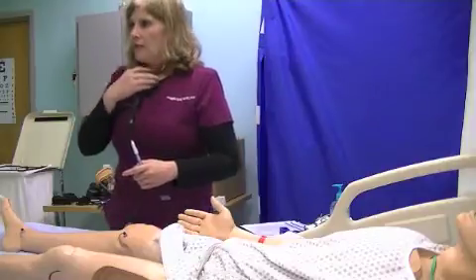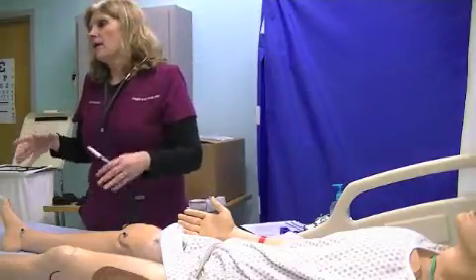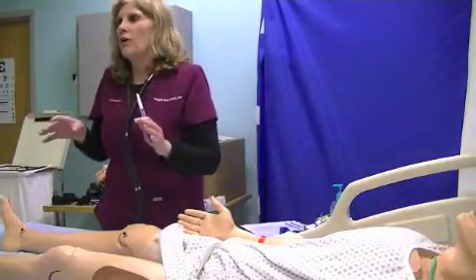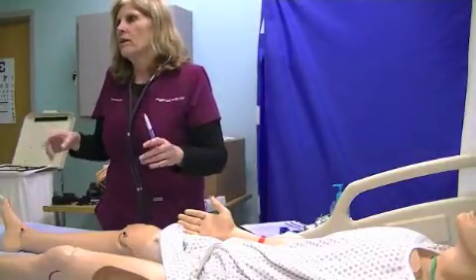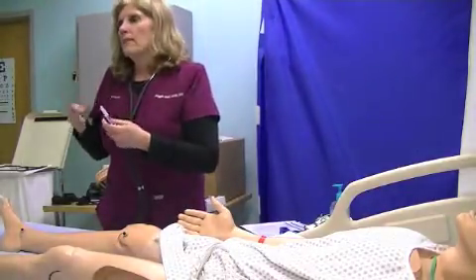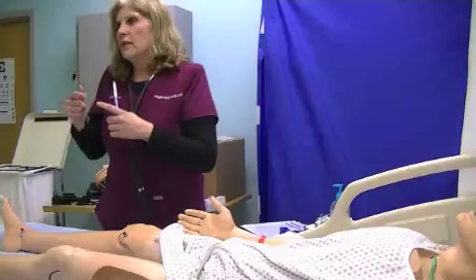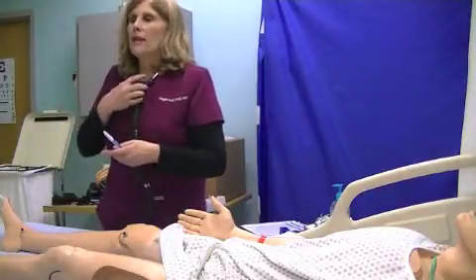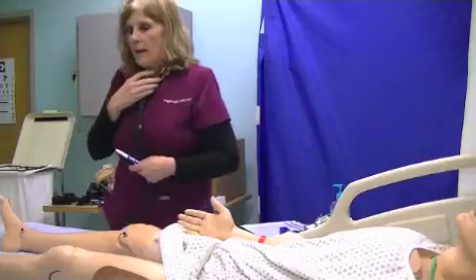Make sure the person, if they have tremors, like they have Parkinson's or a neurological disease, and they shake, it will interfere. It will cause artifact, and they won't get a good reading. Another thing is, if a person has nail polish on or artificial nails, it won't come through, it won't read them, especially if they're a person that has some respiratory problems. Okay?